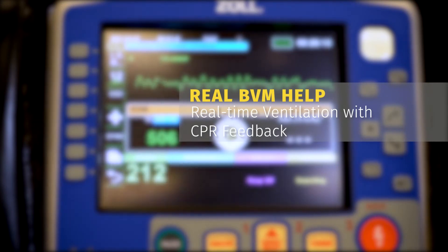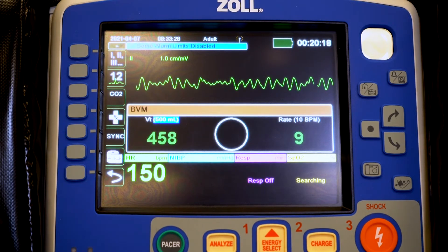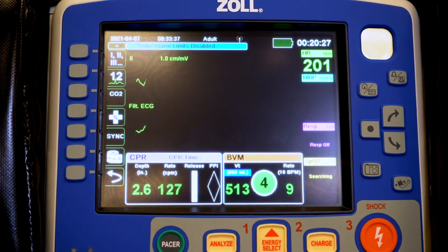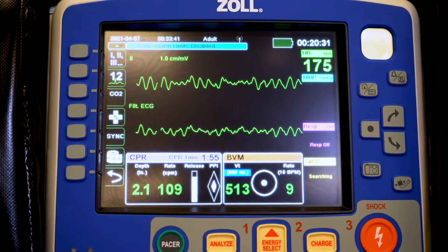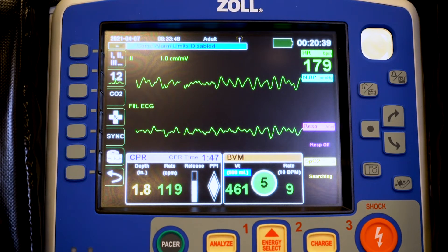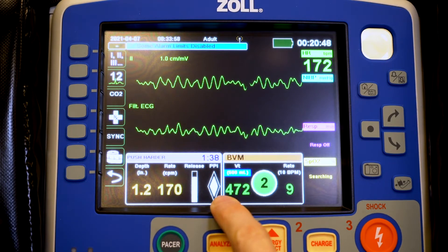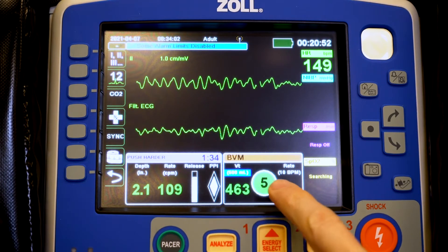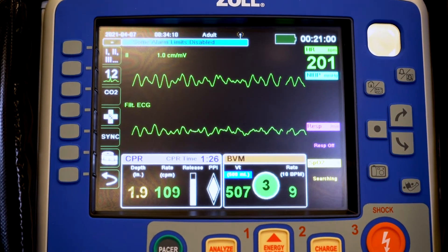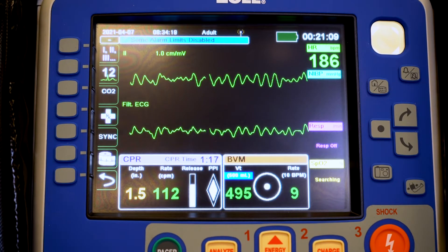Now we're going to show how we have a patient who is decompensating, they've turned into a code, and we need to do CPR. With the BVM feedback dashboard there, when we get CPR feedback it drops our dashboards down to the bottom — we get both of them side by side, a little smaller than what we're used to, but they still give us the same information. We get depth, rate for chest compressions, release or recoil, and our perfusion diamond. With our BVM we get the volume, countdown timer, and rate. We want the monitor pointed to both providers — one doing airway and one doing chest compressions — so they can both make sure they're within parameters on the dashboard.